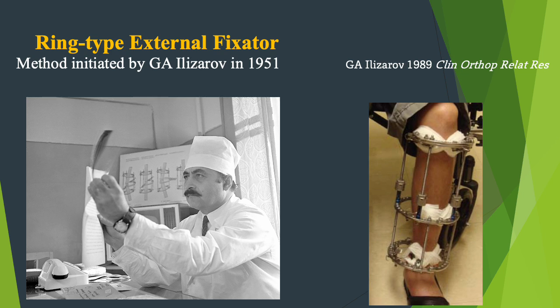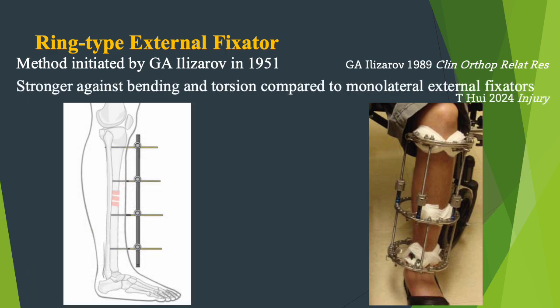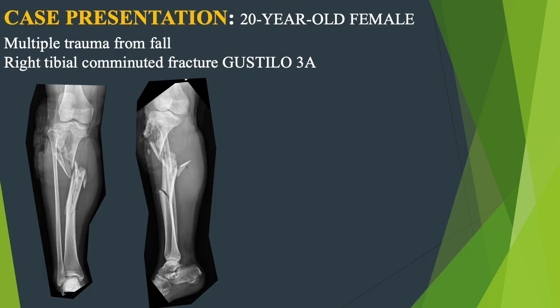Introduction. The Ilizarov external fixator was first introduced by Ilizarov in 1951. Compared to more conventional monolateral external fixators, ring-type fixators were known to provide superior resistance to bending and torsional forces. Let me present a case study.